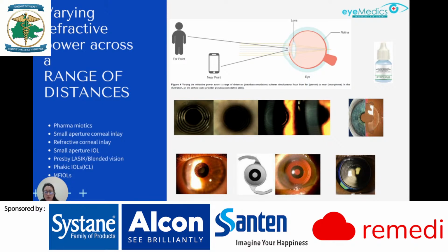Multiple methods can be used to achieve pseudo-accommodation. They can be categorized by the optical principle leveraged to increase the depth of field: small aperture optics, refractive optics, and also diffractive optics on the cornea or on the lens. Small aperture optics, or the pinhole effect, extends the depth of focus by blocking unfocused peripheral light rays and permitting only central light rays to reach the retina. An example of this would be the pinhole intraocular lens or pinhole cornea inlays.